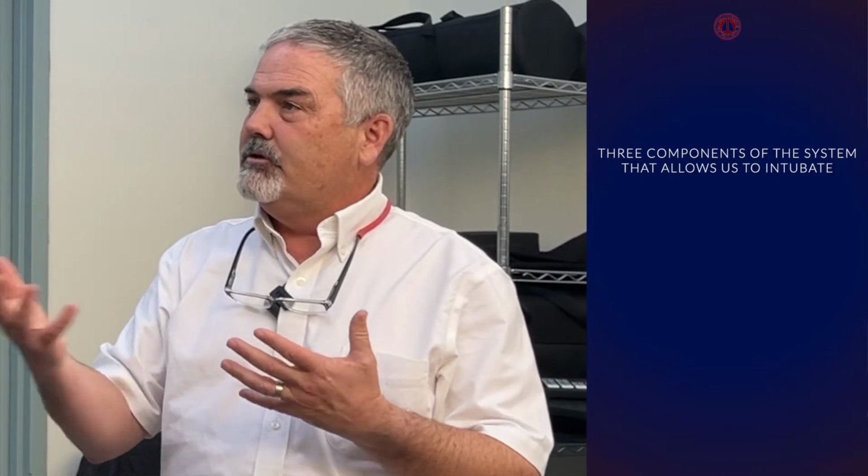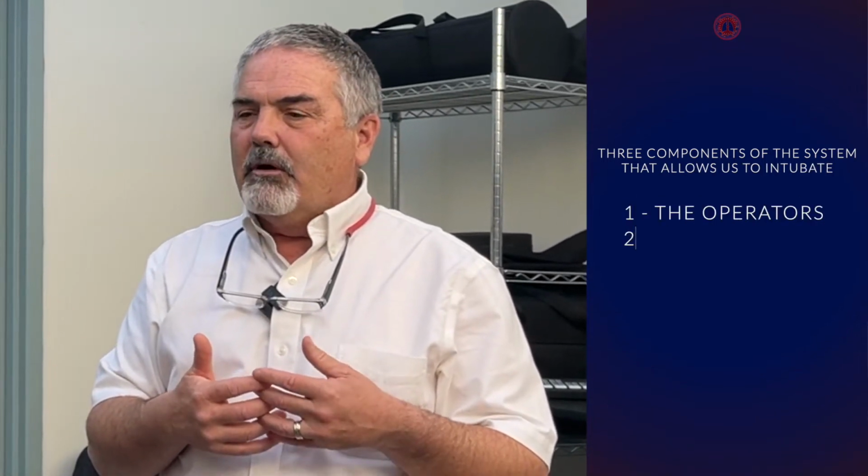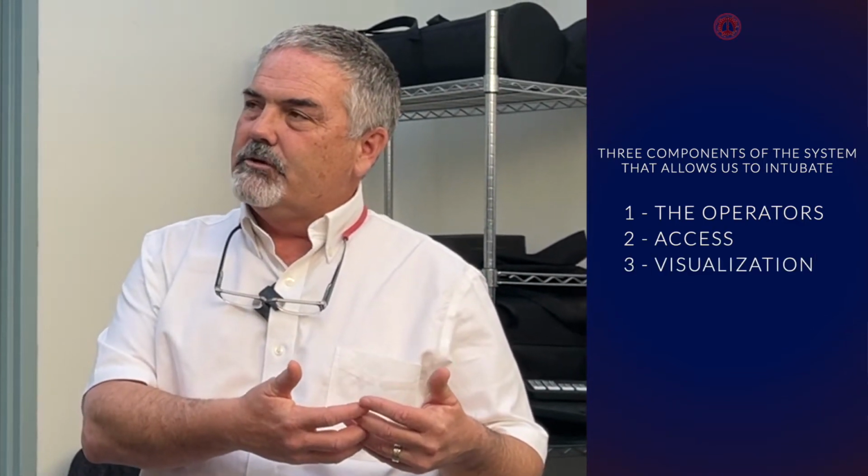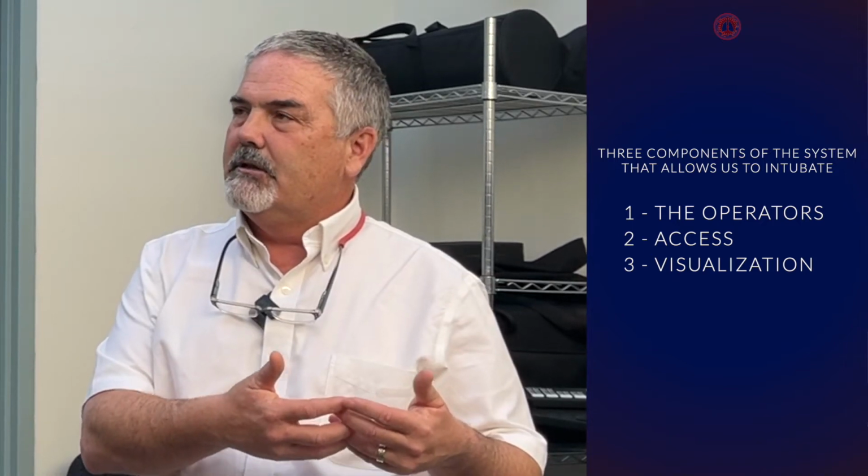I have mostly reflexively thought about it as I've been working on solving the problems. One of the things we really lack is good models for airway management. What is airway management, or what is intubation? The model I'm currently thinking of most is that there are three components to the system that allows us to intubate: the operators, you and I; the access components; and the visualization components. We've really focused on the visualization components, the DL and VL, and that's because of the evolutionary history.